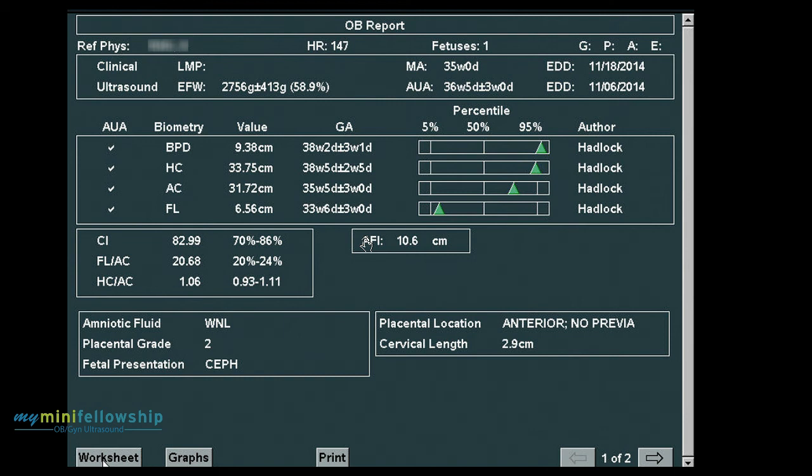So now the worry factor escalates logarithmically, because they think, well, how do I know this is not a skeletal dysplasia? Philly rule number 1 in skeletal dysplasias: never diagnose a skeletal dysplasia if the bones look normal to you. So there's got to be a different explanation.